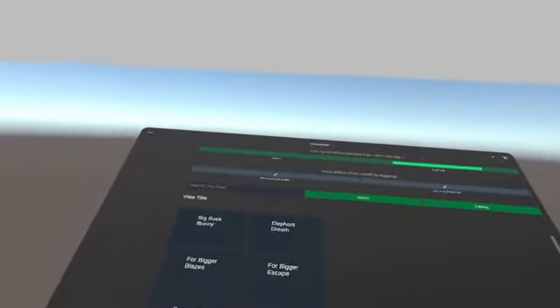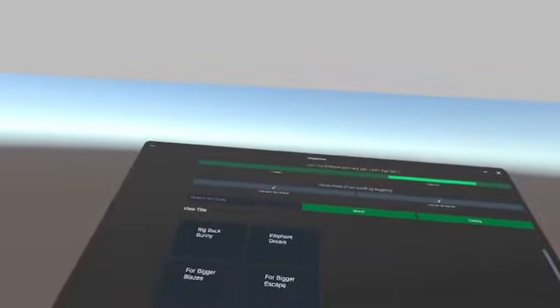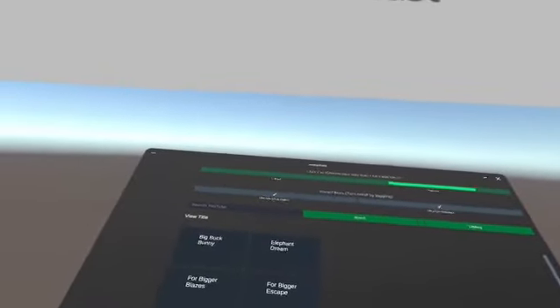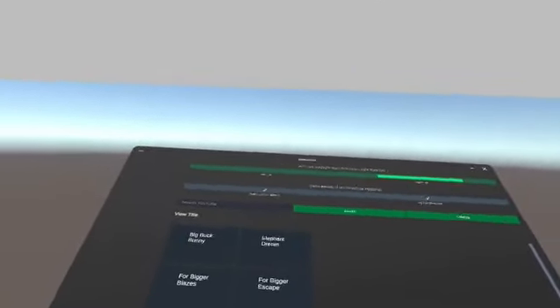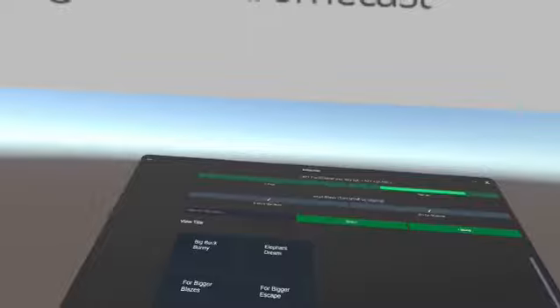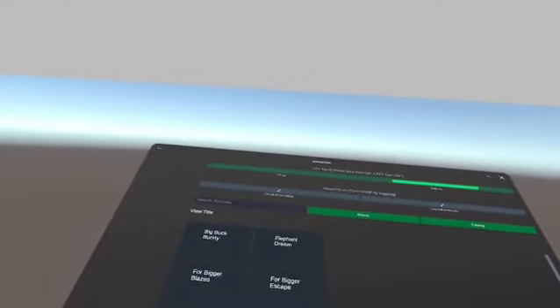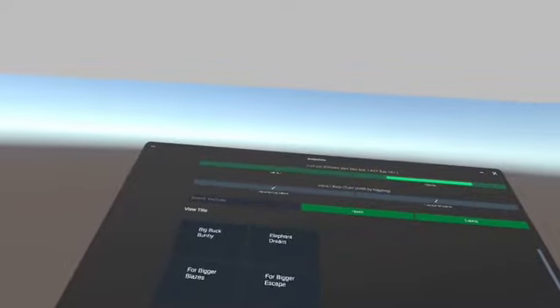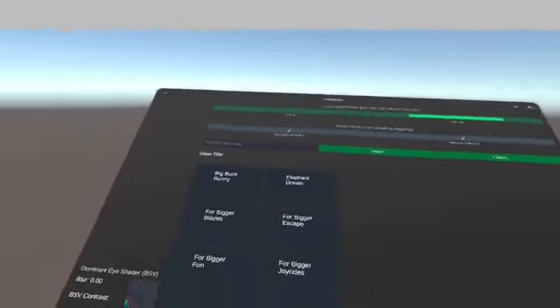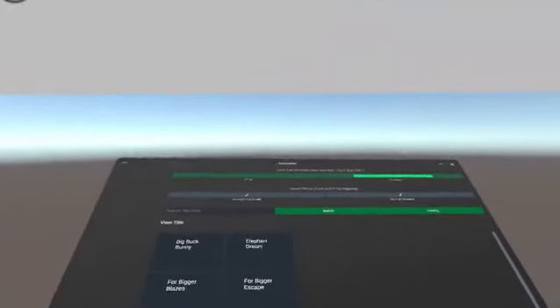But again, patching is the de facto. By using Amblotube, you have to actually use multiple techniques. Amblotube is just one of the techniques. It doesn't mean that you just stop patching or you stop red and blue glasses, because red and blue glasses are also important, because you are working outside in a natural environment, so that is also very important.